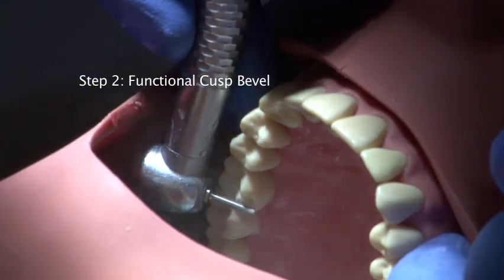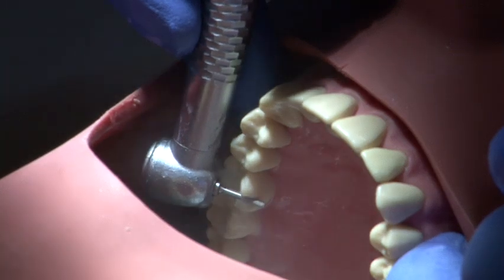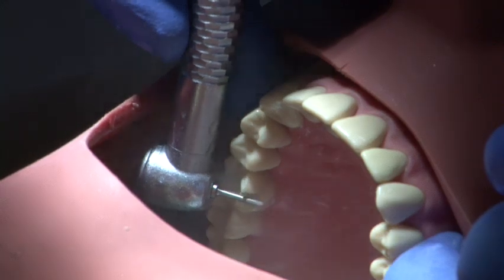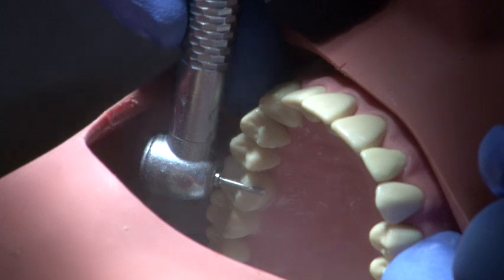The functional cusp bevel is a 2mm bevel placed on the palatal cusps of the upper teeth. Use a smooth continuous action to prepare the tooth.